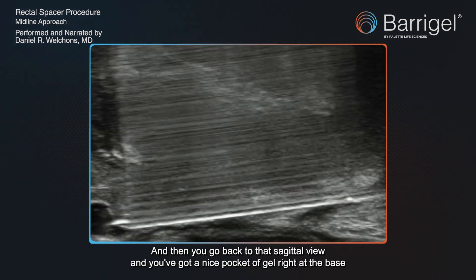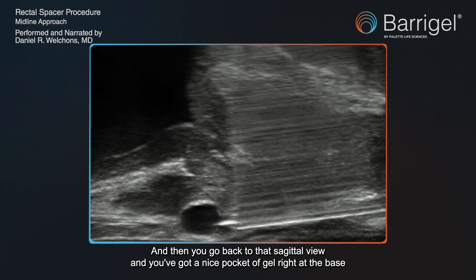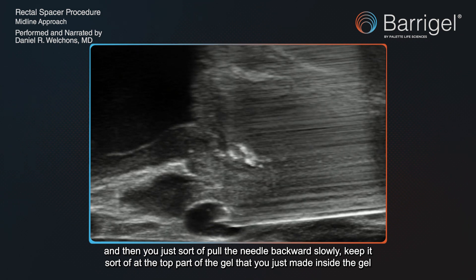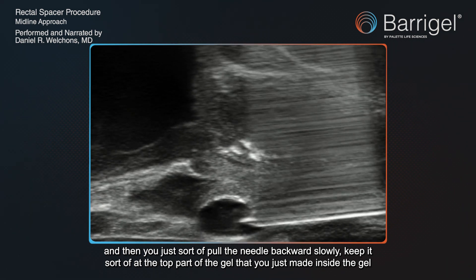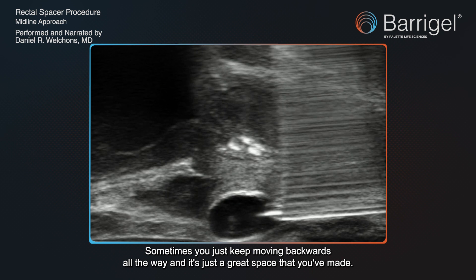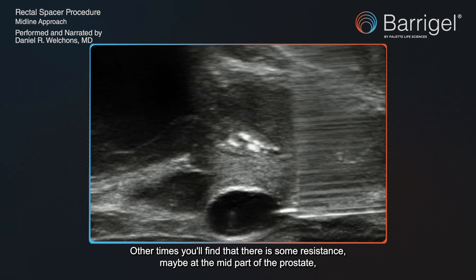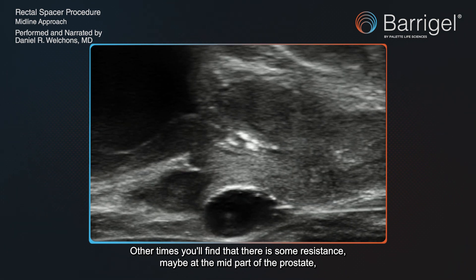Then you go back to that sagittal view, and you've got a nice pocket of gel right at the base. You just pull the needle backwards slowly, keeping it at the top part of the gel that you just made, and you see it kind of open up. You just slowly move backwards — sometimes you keep moving backwards all the way and it's just a great space. Other times you'll find some resistance, maybe at the mid part of the prostate.